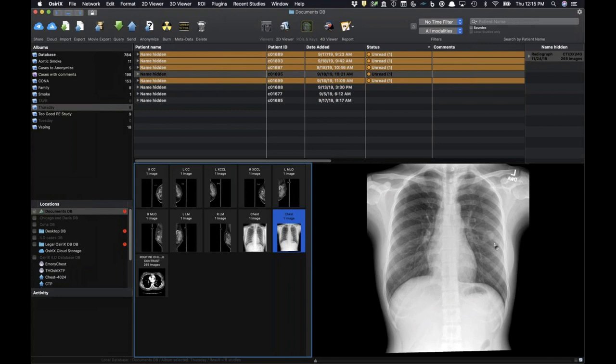I don't know. Sure. Do you guys still commonly do them? I wish we did more. We do. I mean, so many times it's so helpful, either to confirm something or more often to refute that something's there. Yeah. I think one of the arguments is reducing radiation in these patients, but then you have something like this that could have arguably been saved, you know, instead of one lateral, they got a CT instead. But granted, that doesn't work across the whole population, but in one specific patient, it does.